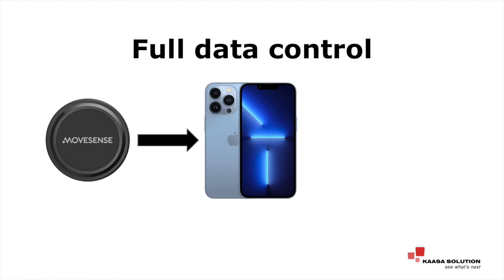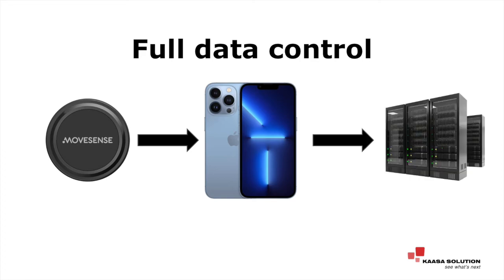So that then goes to the smartphone. But if for ethical or whatever reasons you don't want to send it to a server, it doesn't go there. But you can obviously also send it to a server via MQTT or any other process. That's all done within our modules. So you can decide it on your own, and it's not something that you need to do.